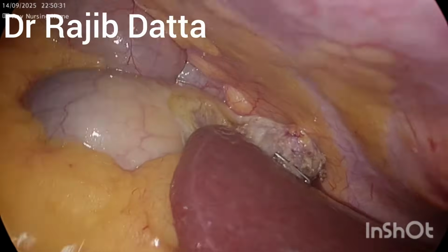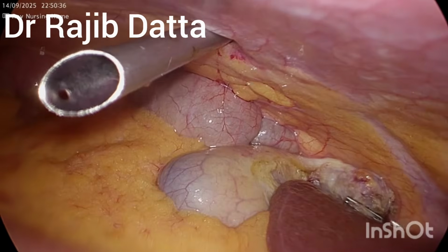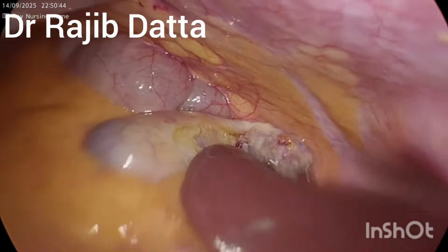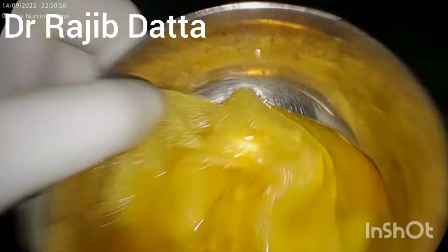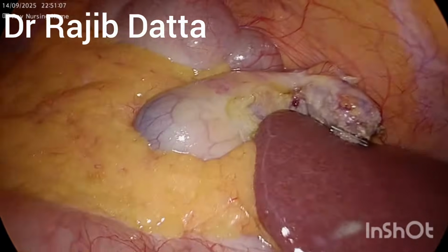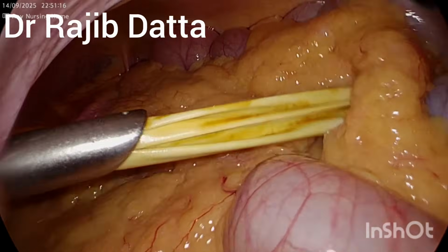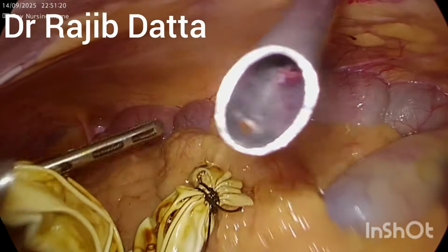And after that we will thoroughly clean the peritoneum, intra-abdomen. Thorough peritoneal lavage will be done. So the 10 mm mid-epigastric port, the telescope has been introduced, and the glove has been introduced through the umbilical port.